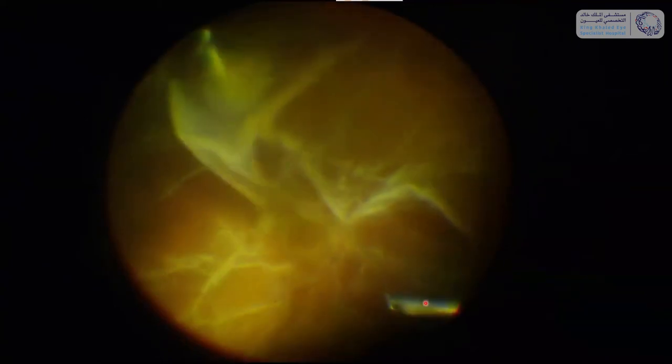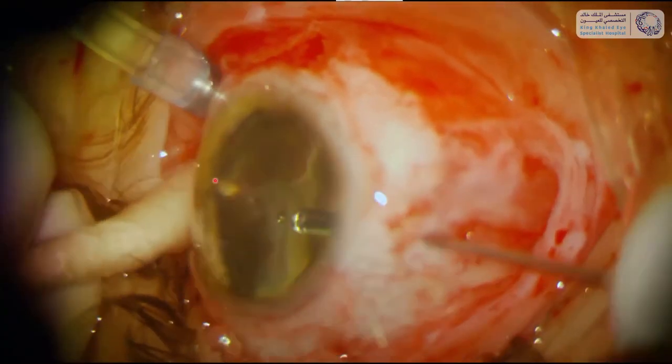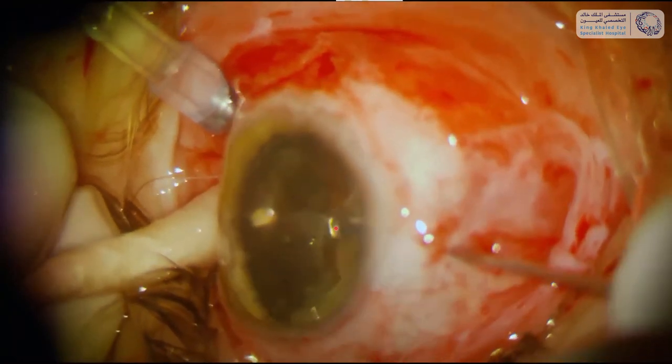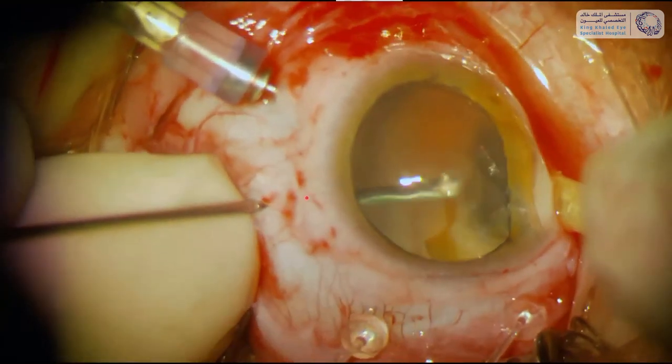I use my light fiber as a roller to roll the subretinal strand over, and I'm approaching it with my left hand — going under the retina through the peripheral retinotomy. You can see the tip of the instrument, and that way maneuver it into the correct position to remove the subretinal strands. Now you see how the retina is being dragged towards the retinotomy — we have retinal incarceration — and that's why I'm indenting the eye and doing a peripheral retinectomy.